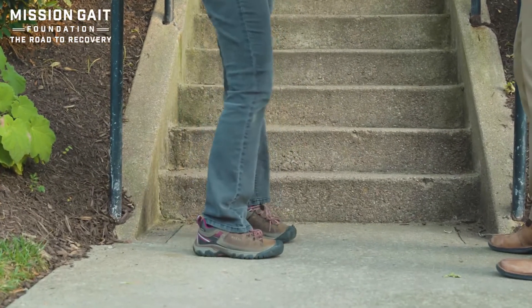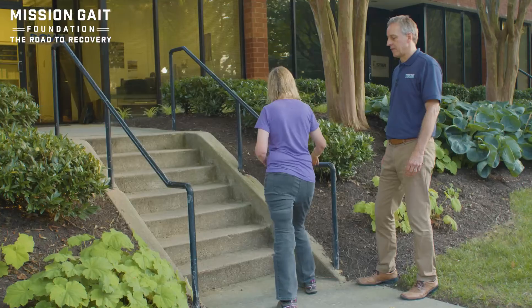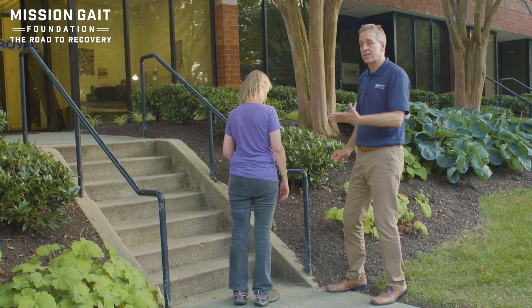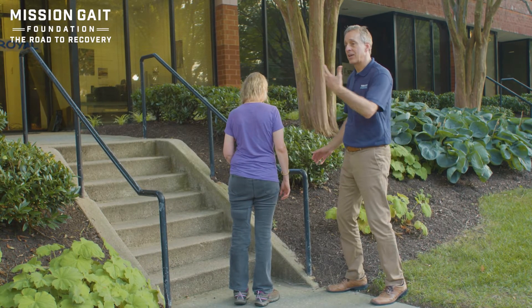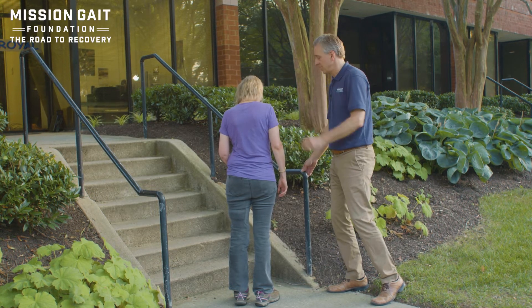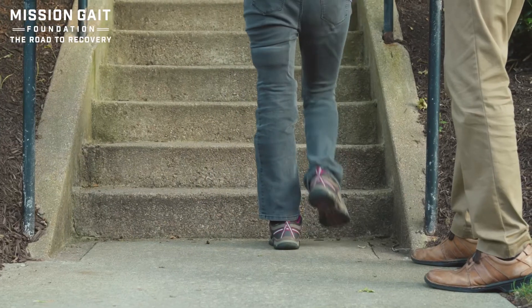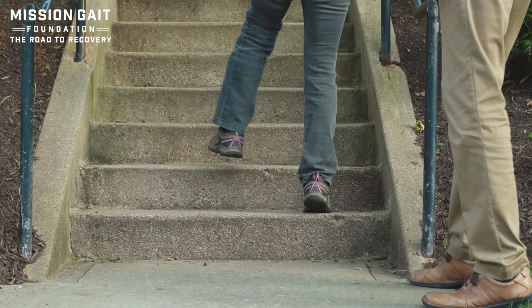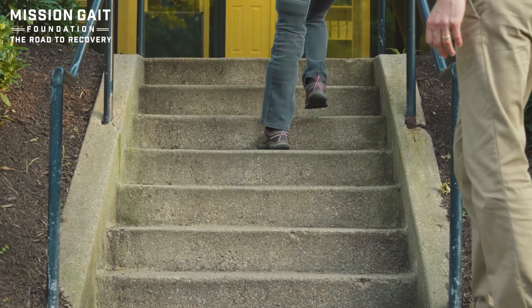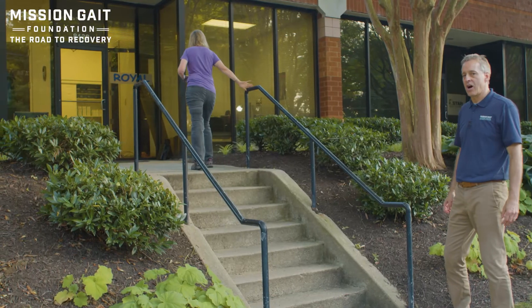Come down. If she has the strength, she can also use some of her tone to go leg over leg. If she can get her lead leg up, then use some of that tone as she leans forward to get lift to elevate up the step. So she can clear that foot, load onto that tone, and get that tone back to give her a good extension lift to go up the steps. That takes more strength and confidence.